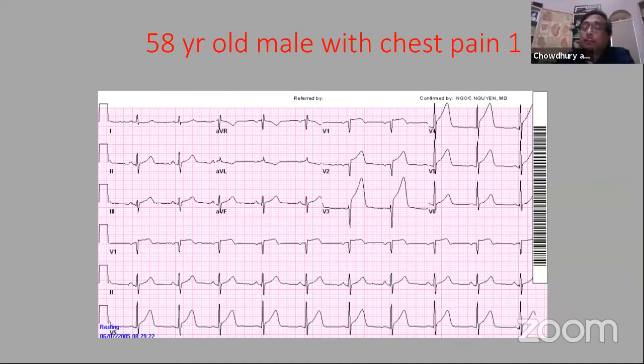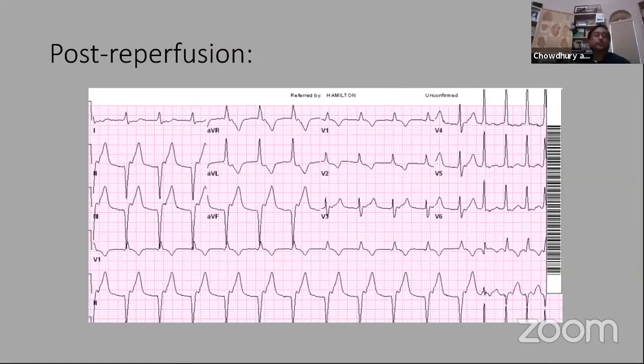And now, at the request of Rafique Bhai, I'm going to bring some other compounding issues, such as post-cardiac arrest and shock, how we can, what I call, smell the bigger trouble by the EKG and then clinical presentation, and what we do. So this is simple, right? While we are taking this patient to the cath lab, we give the patient antiplatelets and anticoagulation, and after the first injection in the cath lab, we see some TIMI 3 flow with high-grade stenosis. With the injection, the artery opened up and this happened. What to do?